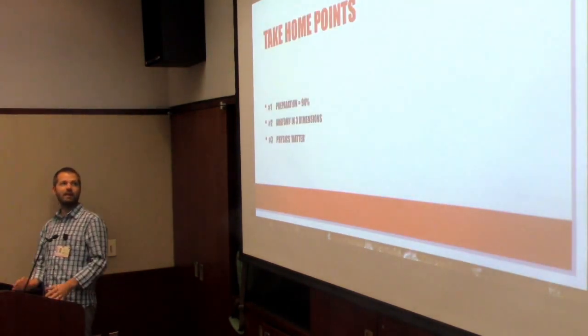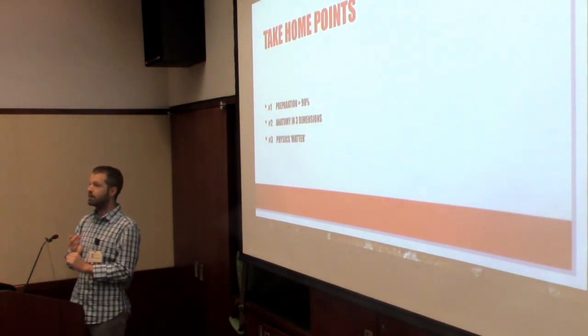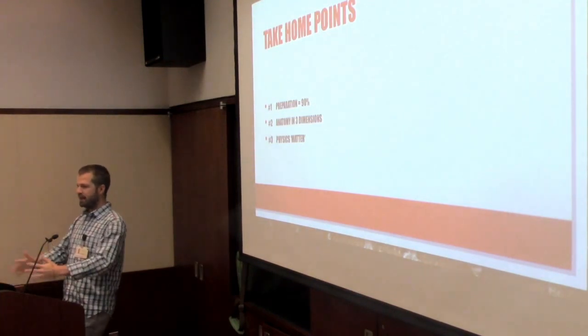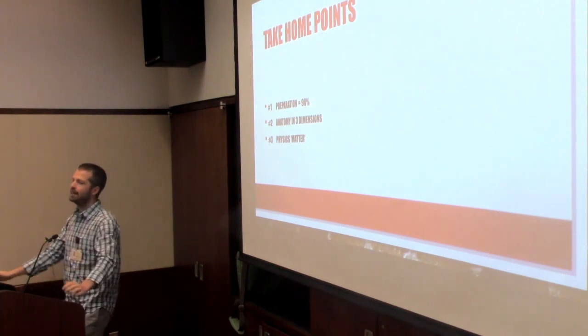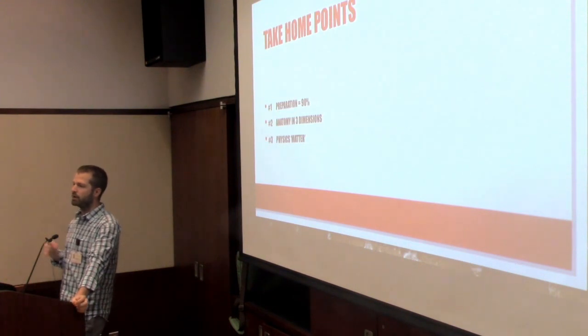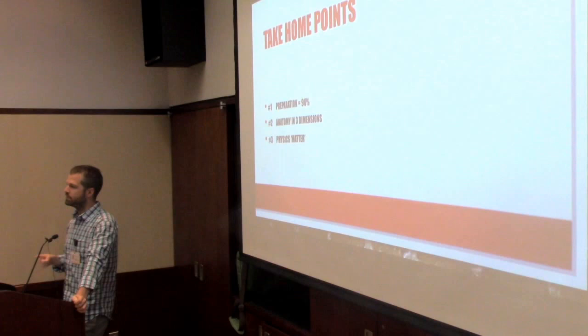We're going to start with our take-home points. So 3 big take-home points. Prepare. And that means a lot of things. It's not just setting up your tray in a nice, beautiful fashion, organizing things alphabetical by height. That's just one tiny step of preparation. A lot of it is thinking about what you want to do for the patient. A lot of it is getting the patient in the right position.